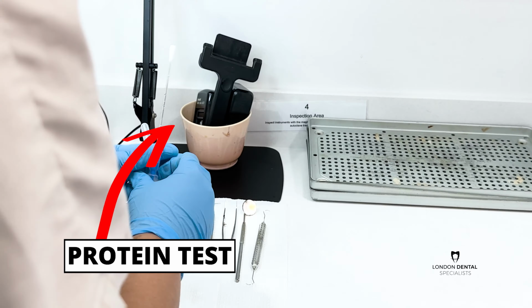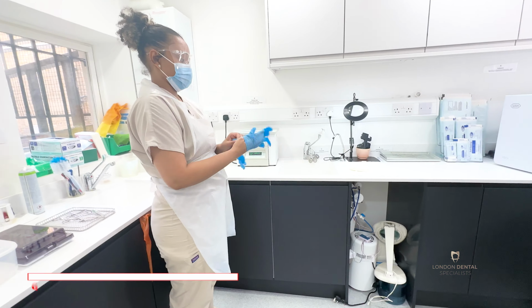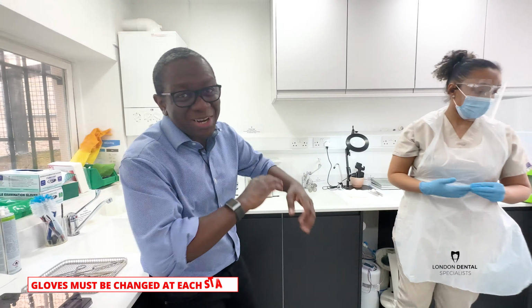And so the liquid that was in the top there has now been pushed down onto the swab. If the liquid is green, then it's fine. If we see anything other than green, the instruments are essentially reprocessed. And that way we know that not only are the instruments free of visible debris, they're also free of proteins. We like to ensure that everything is tested to make sure that you're always safe in our hands.